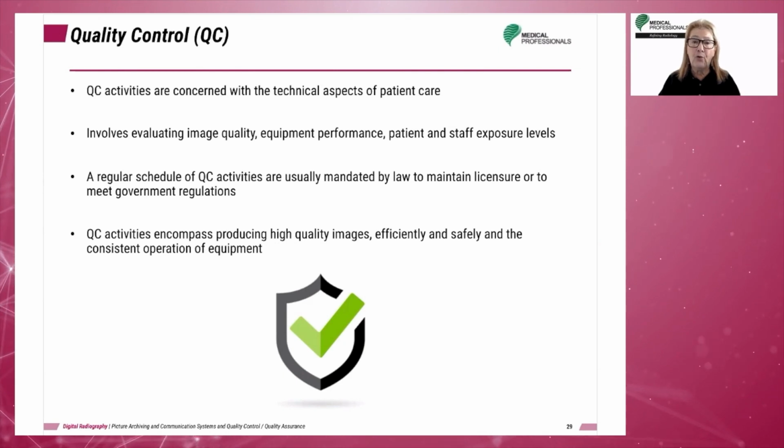Quality control, or QC, activities are related to the technical operations of the department and are part of the overall QA program. Quality control activities monitor equipment performance to ensure it is operating at a consistent level and is properly maintained. QC processes attempt to ensure high-quality images are produced safely, consistently, and efficiently.